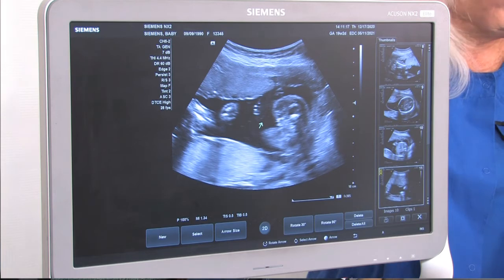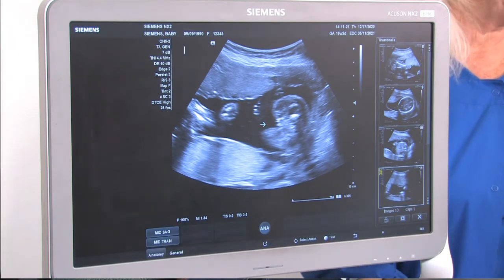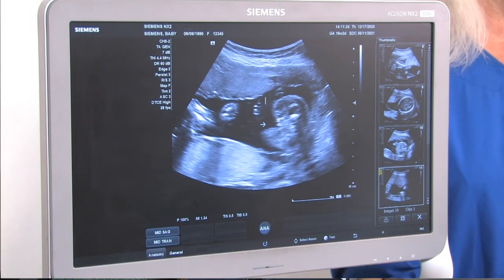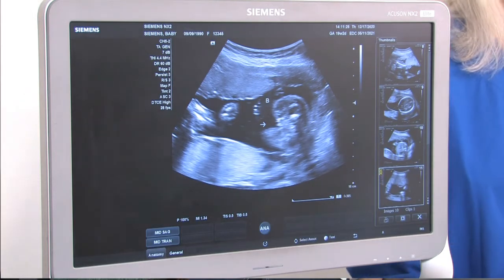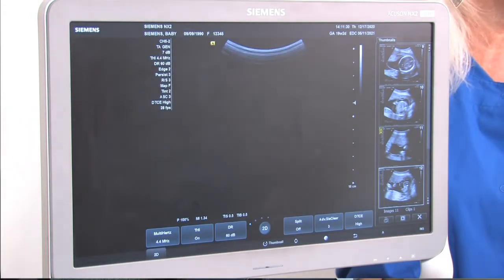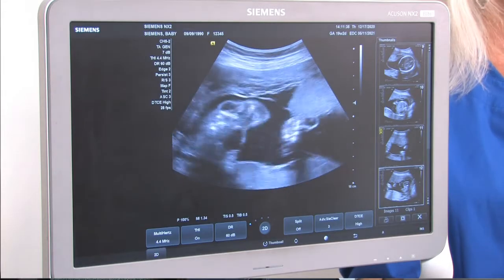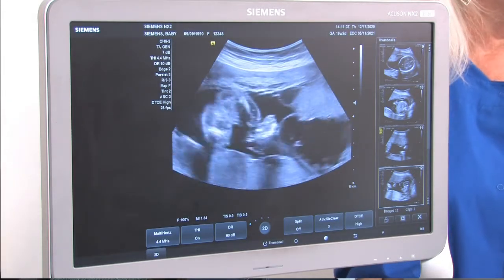It's like, look. You look for what they call the hamburger sign, or the 3 lines. Did they tell you that? I know. The boys are real obvious, and for girls, nothing there. The girls look like a hamburger, and the boys look like a turtle. Oh, okay. I had 3 turtles. Aww. I know.